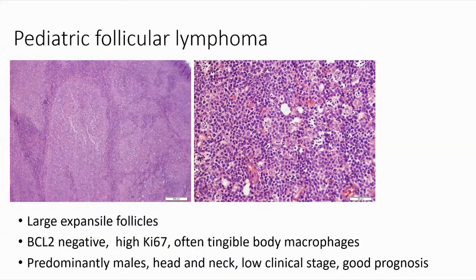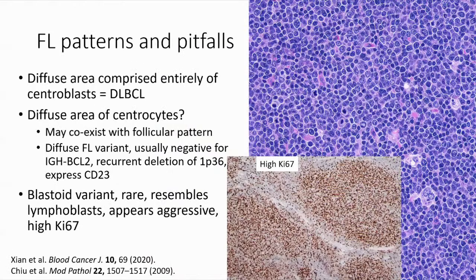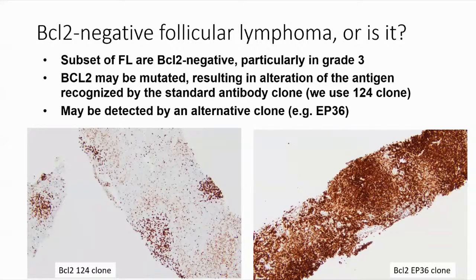And so you would know that these are not normal follicles. This is also the same case where I had stained it with the kappa lambda ultra ISH, just because it's a particularly nice example, and they're all lambda. So this is a clone, but I think you could arrive at that suspicion even from the morphology of those.